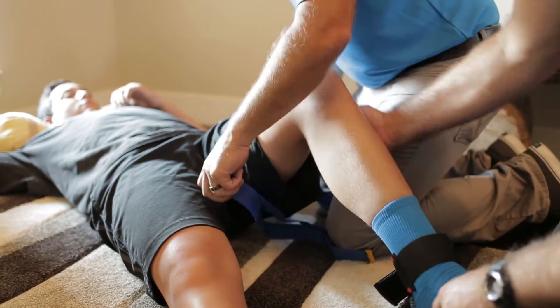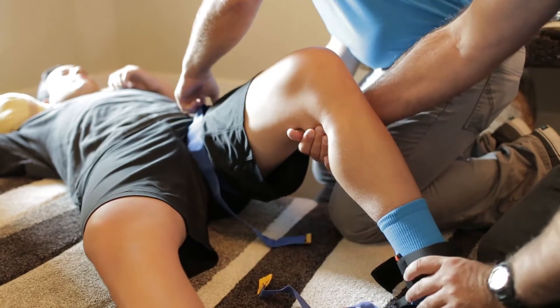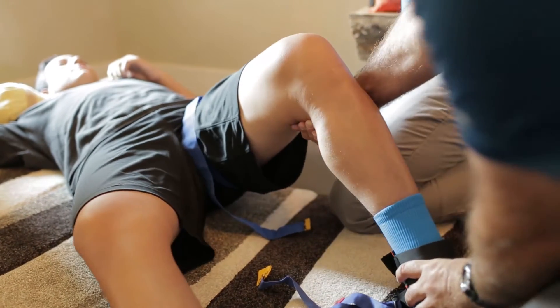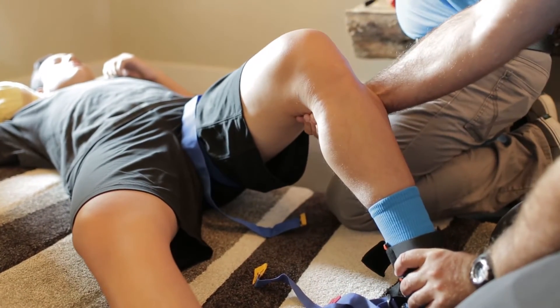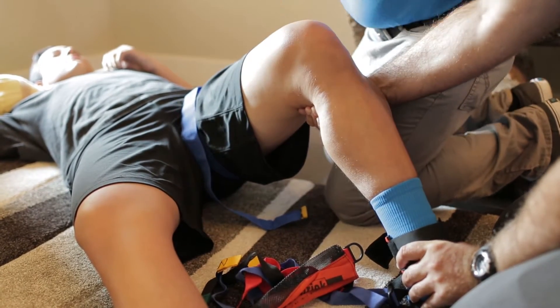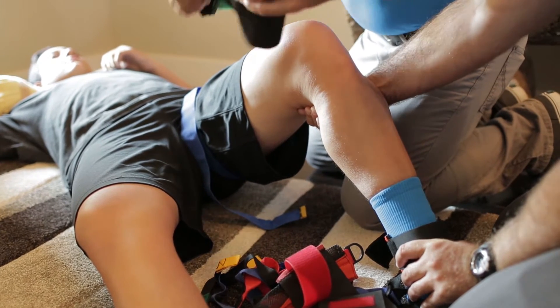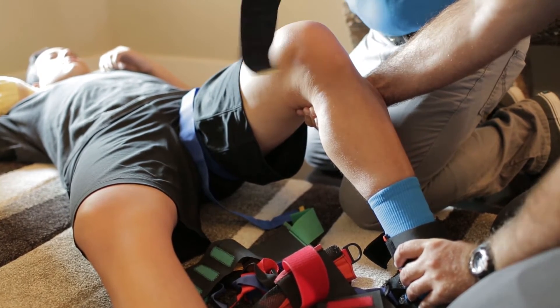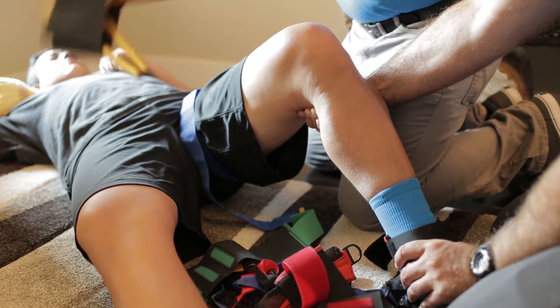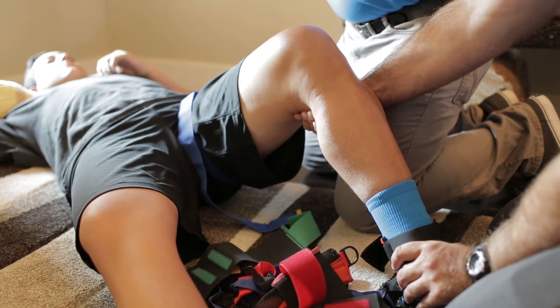Anytime we have a femur fracture — the thigh bone is broken — there's a lot of pain for the patient because that muscle begins to contract and spasm. Rescuer 1 is going to put one hand underneath the knee, the other hand under the ankle, and pull manual traction — just rock back into position, and that's going to pull traction on that leg. Obviously, we won't be able to hold that for very long, so this is where we're going to use the traction splint.